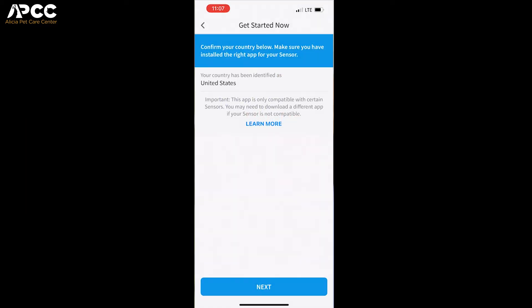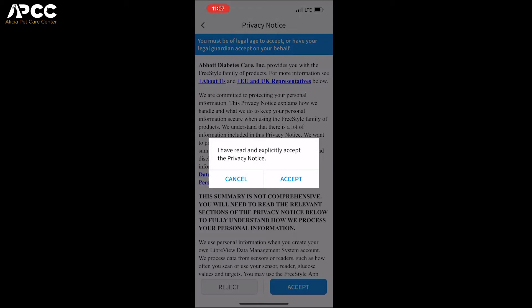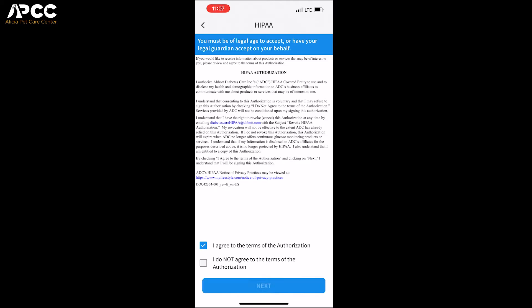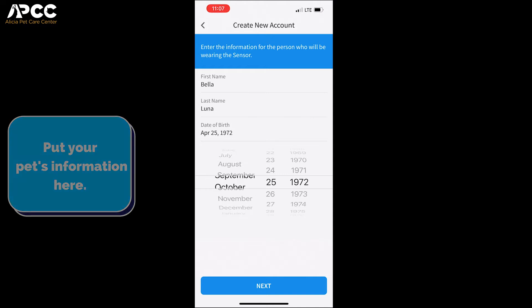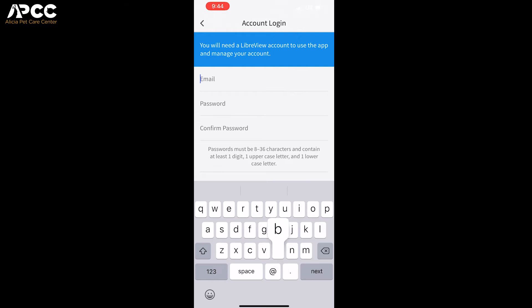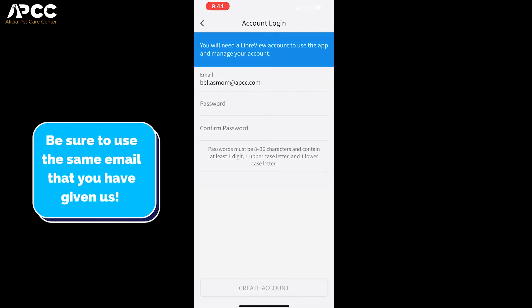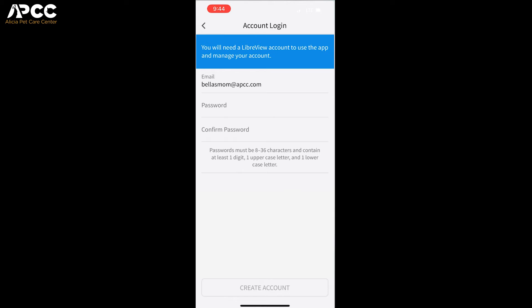Hit Get Started Now. It's going to say that your country has been identified as the United States — click Next, then Accept. You're going to put in the patient's first name, last name, and birth date. If your pet is younger than 18 years old, which most pets are, you will also have to input your information, but that's okay because you are obviously the one controlling the app. The most important thing to keep in mind is that the email you make for this account has to match the email that you have provided us in the past, because that is how we are going to link your account to the Alicia Pet Care account.